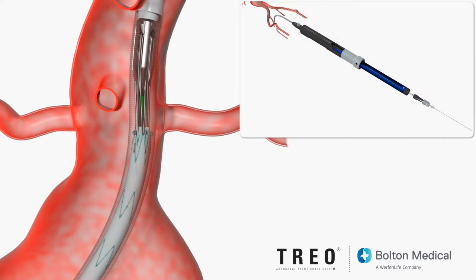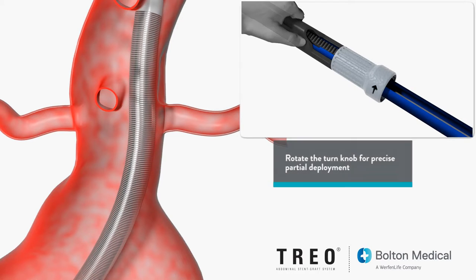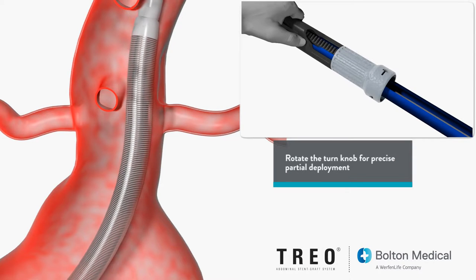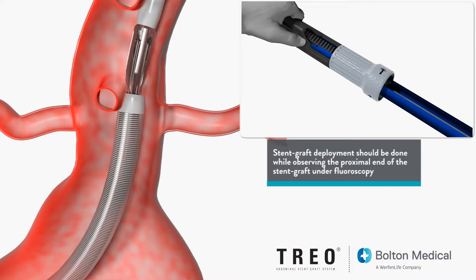To deploy the main bifurcated stent graft, hold the stationary grip and rotate the turn knob in the direction of the arrow to start initial deployment of the stent graft. Observe the proximal end of the stent graft as it starts to deploy.